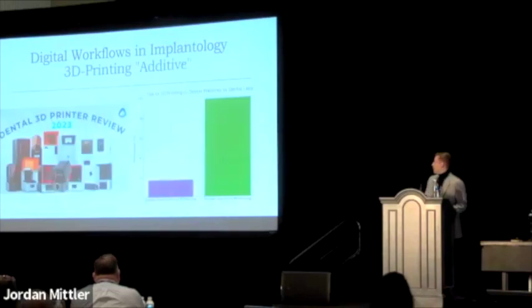And that brings us to 3D printing, which is also known as additive manufacturing, because we're going from liquid resin that's being cured in very thin layers up into our final product. So, this is showing that almost 100% of dental laboratories are utilizing additive technology, and still under 20% of dental offices are utilizing it. And I think that will continue to change very rapidly.